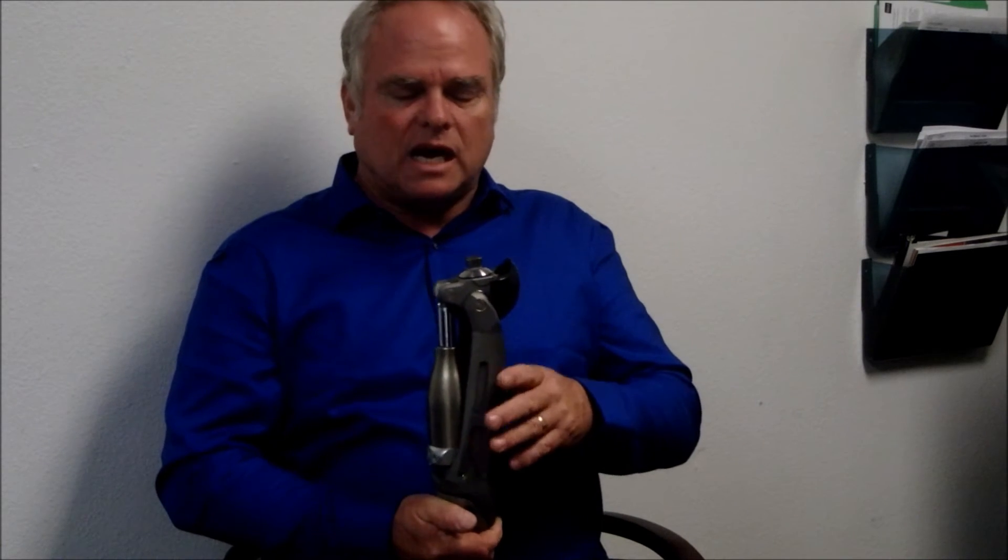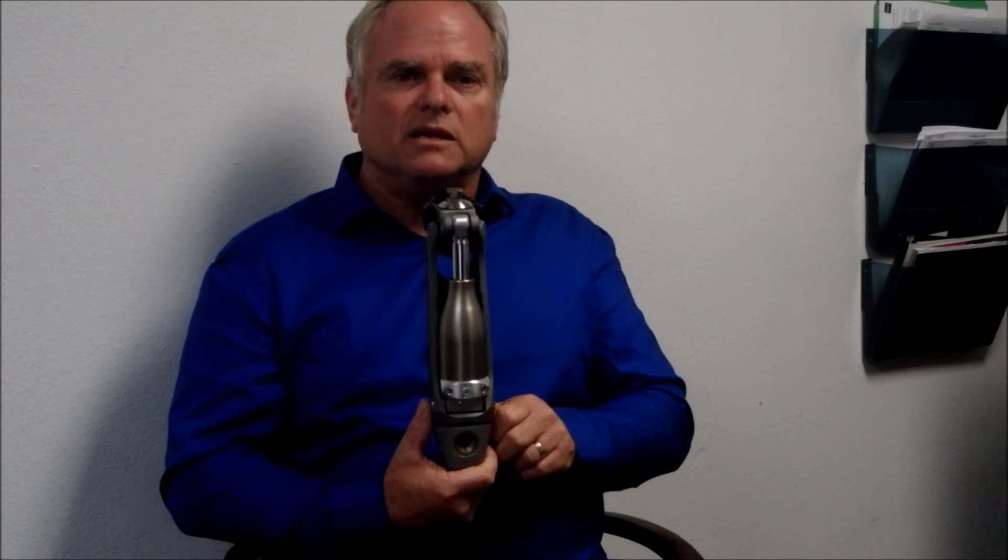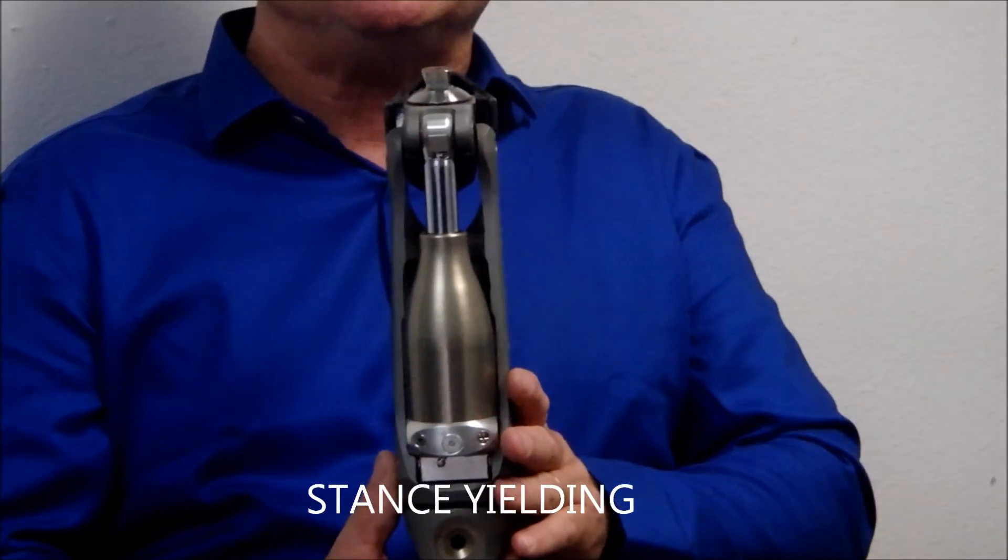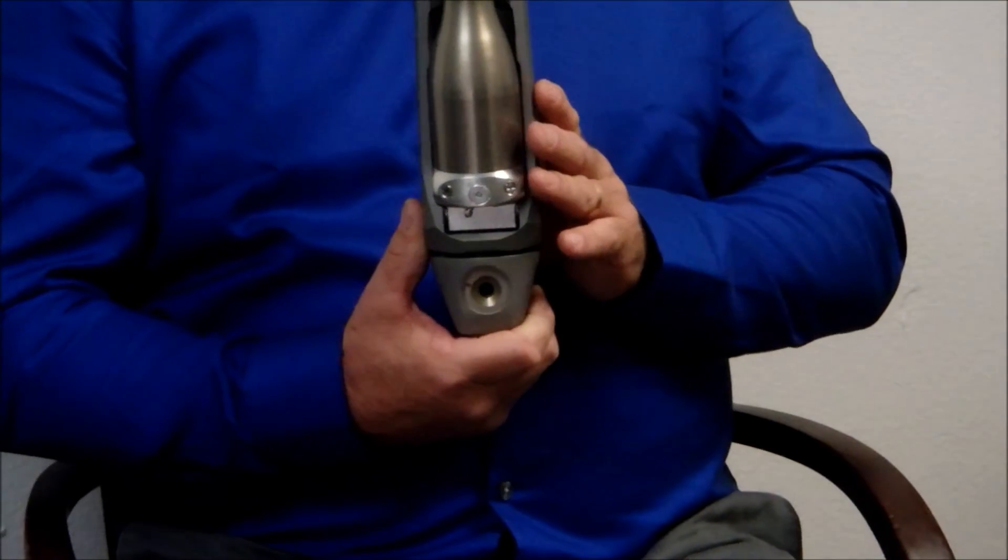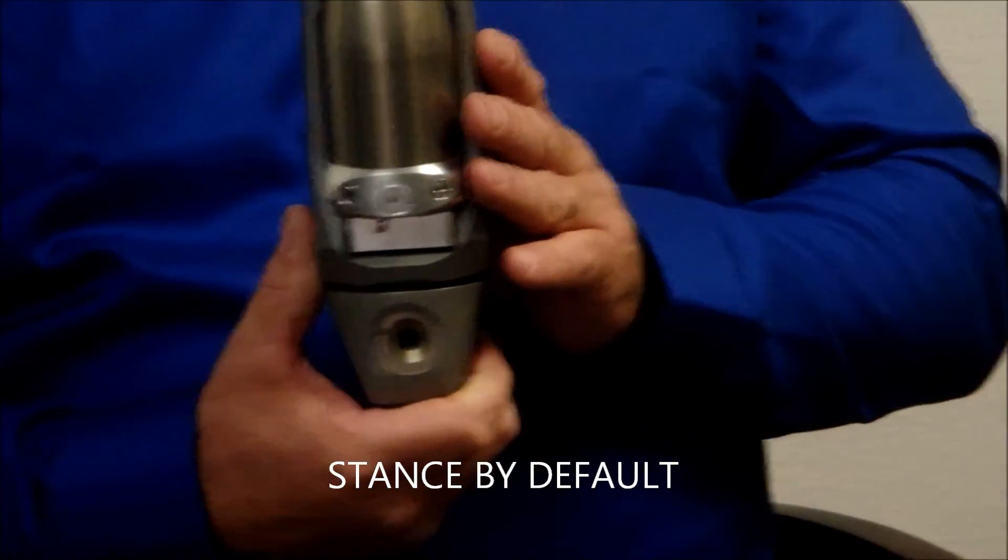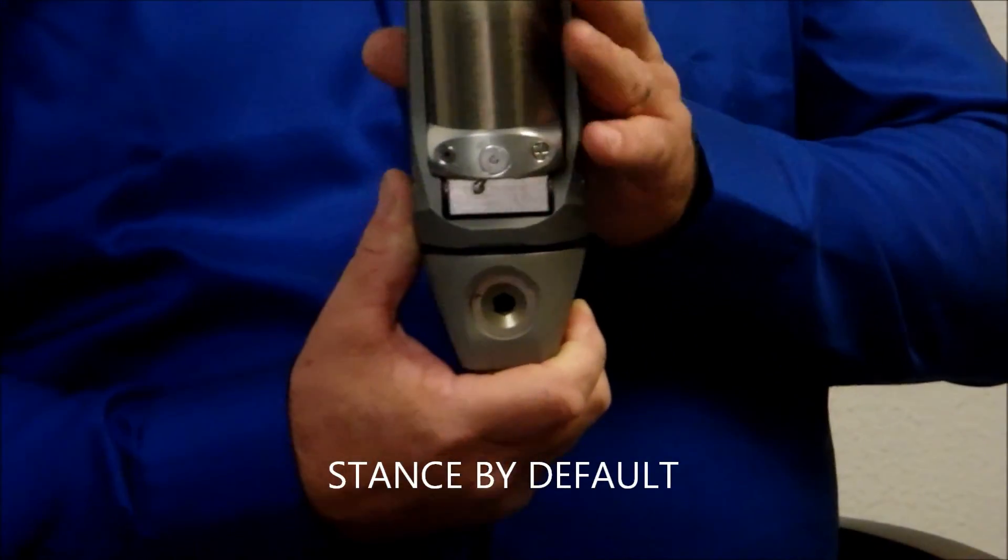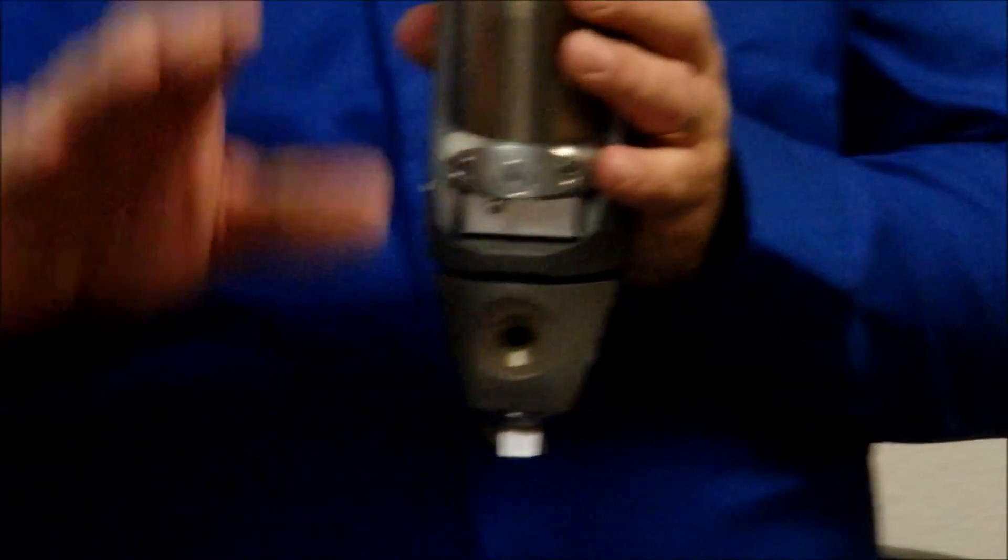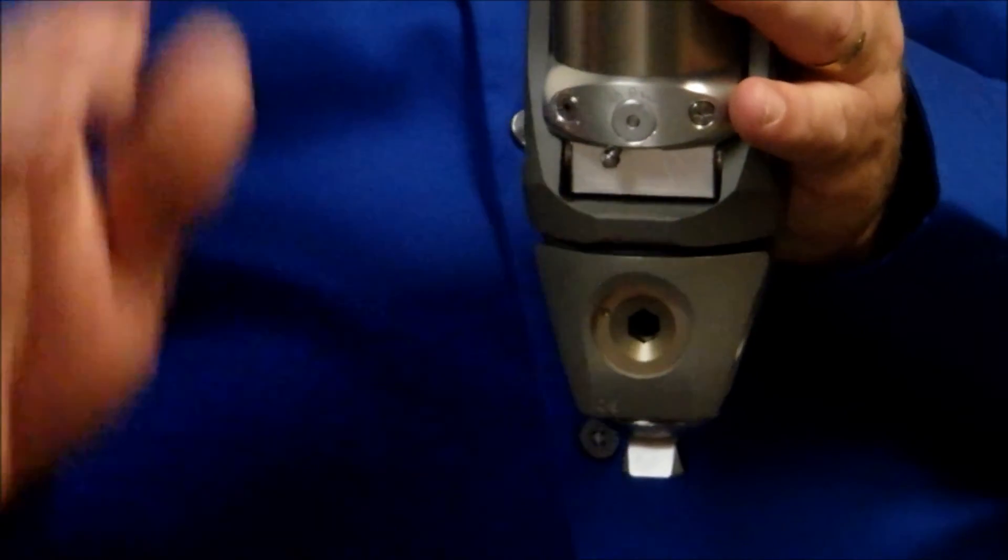First item as far as adjusting the knee is we are now going to talk about stance yielding. This knee is stance by default. So, like in many other knees, what we're going to do to adjust the knee is we're going to have the patient stand and sit.